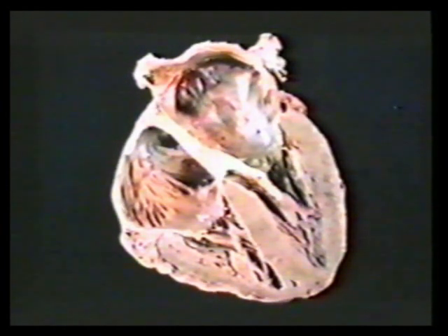In this case, the endothelium on the left side and the mitral valve also appear involved. When this happens, one must exclude a right-to-left shunt. However, left heart involvement is also seen with active pulmonary metastases or when the primary tumor is a bronchial carcinoid. As with the tricuspid valve, carcinoid involvement of the pulmonary valve results in retracted, rigid cusps.